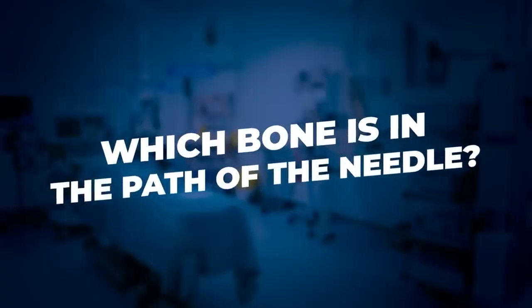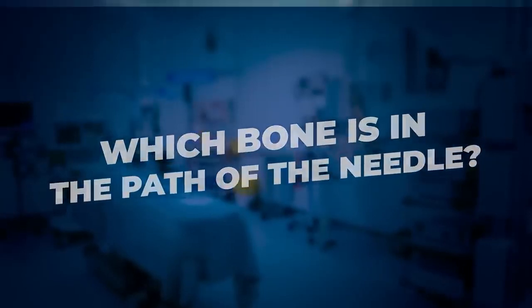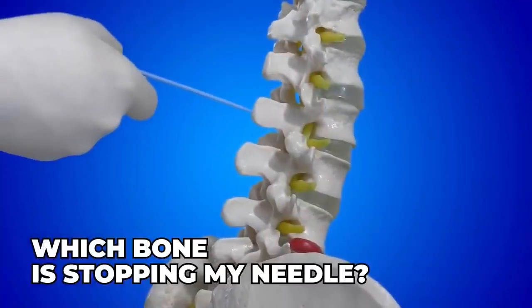Such a minuscule change in the insertion site of 1 millimeter or 2 from each other cannot possibly make any difference to the location of the needle tip, which is 5 to 7 centimeters deeper. In an ideal scenario, the needle would never encounter any osseous structures, but when it does, you must stop and ask yourself a question: which bony structure is on the way of the needle now? There are 4 typical scenarios.